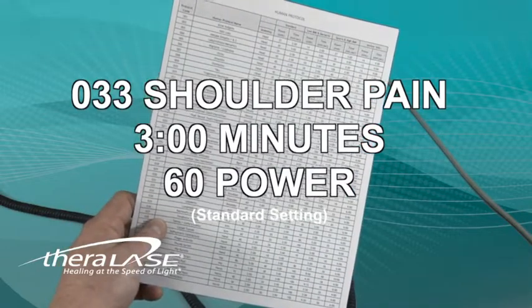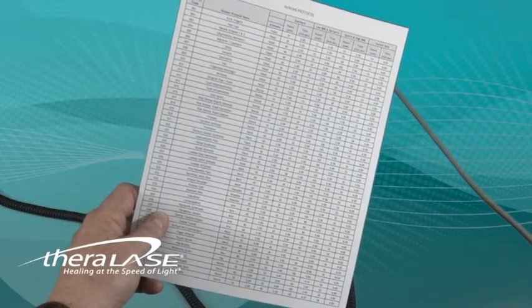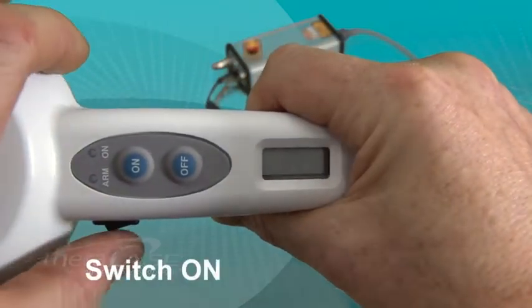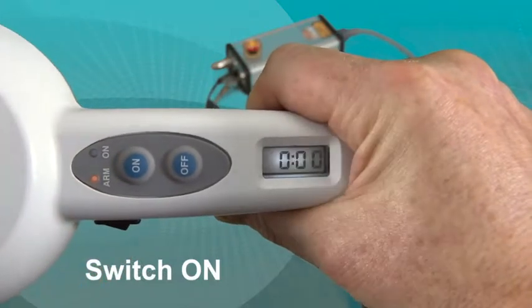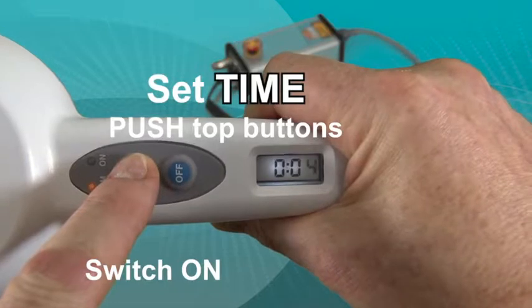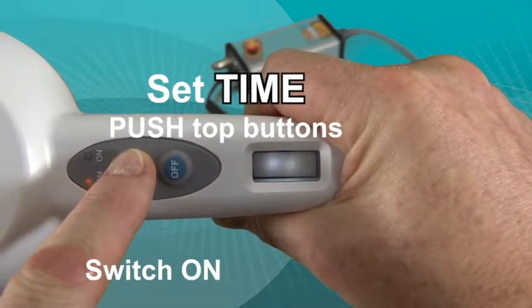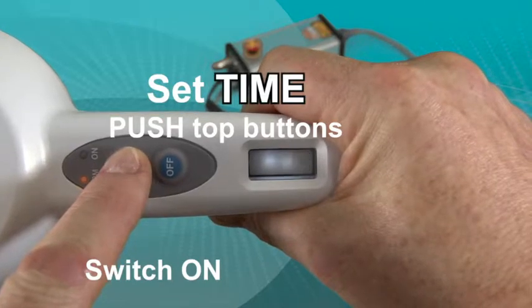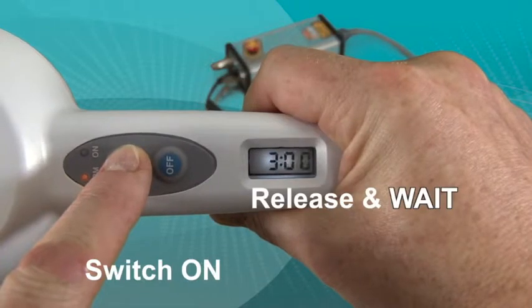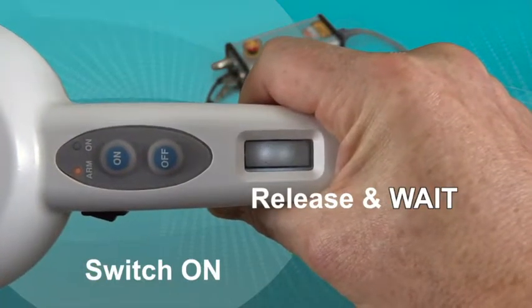First, we will set the time to 3 minutes, and then the power to 60. While programming these settings, we will be paying special attention to the numbers that are blinking on the LCD screen, as well as the beeps that are confirming the settings and letting us know to move to the next step. Press the buttons to change the numbers on the LCD screen — the on button will move the numbers higher, and the off button will move the numbers lower. Pressing and holding the button continuously will speed up the process.